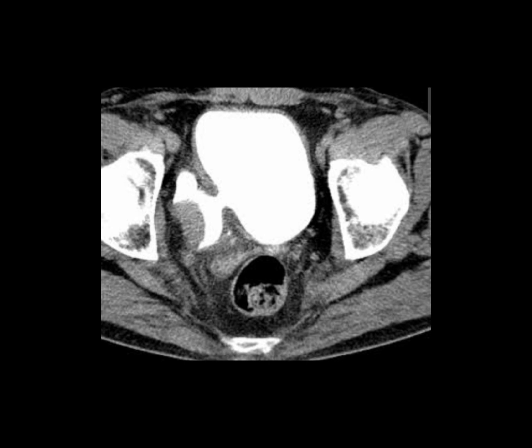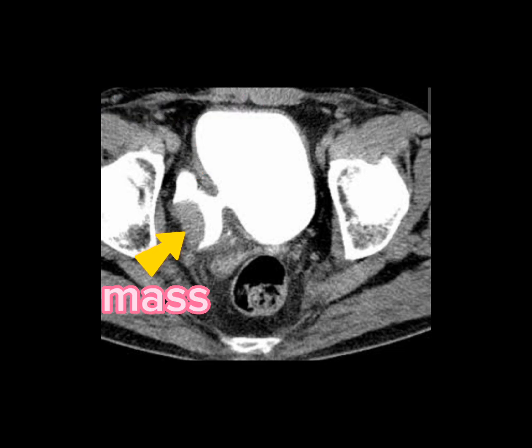This is another example of CT examination of the pelvis on post contrast study, showing a contrast-filled urinary bladder with a prominent sized diverticula around the right posterolateral aspect of its wall. There is soft tissue growth in this diverticula which is suggestive of transitional cell carcinoma.